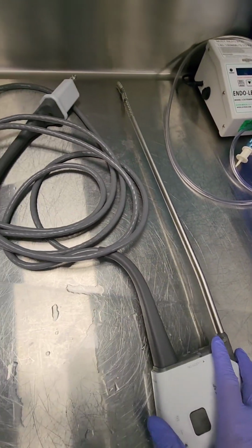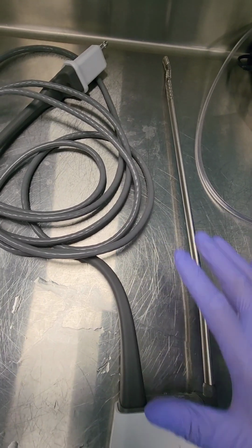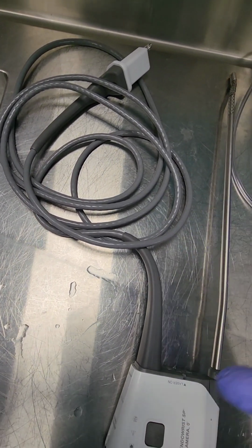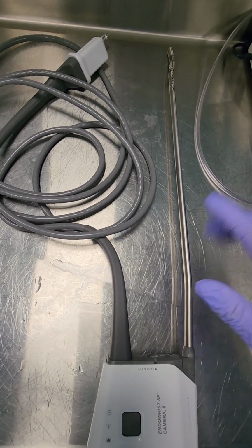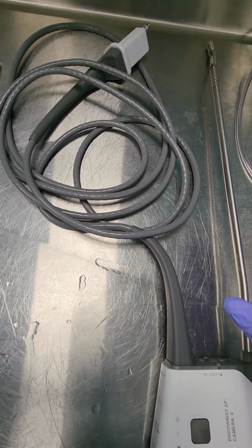You're going to rinse the device after soaking and brushing. Rinse the device under cool water. Flush the ports with cool water. And again, brush those hard to reach areas to ensure that there was no chemistry left behind or caught. Okay. Also, taking care of that cord as well. Do not ignore the cord. The cord is part of the device and should be cleaned accordingly.